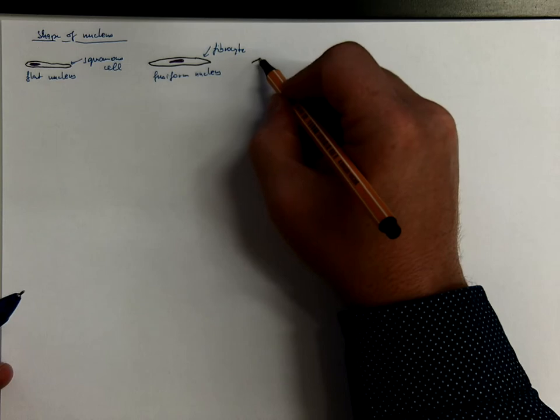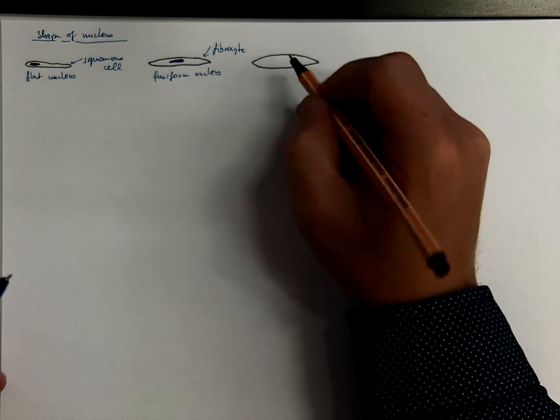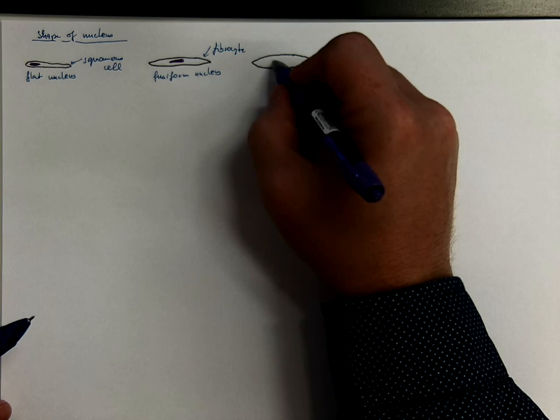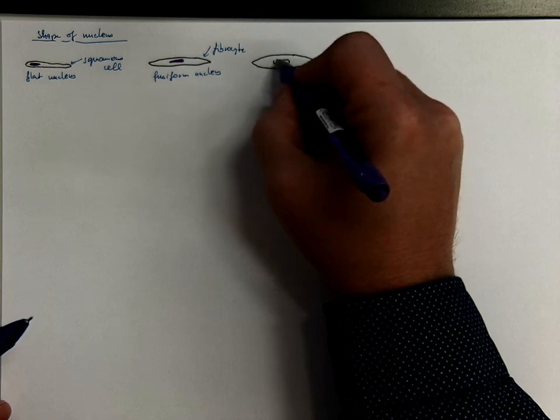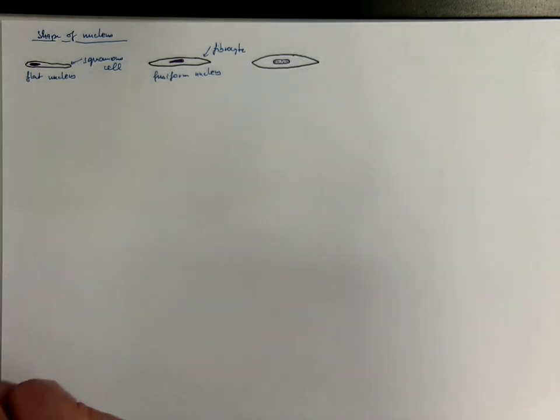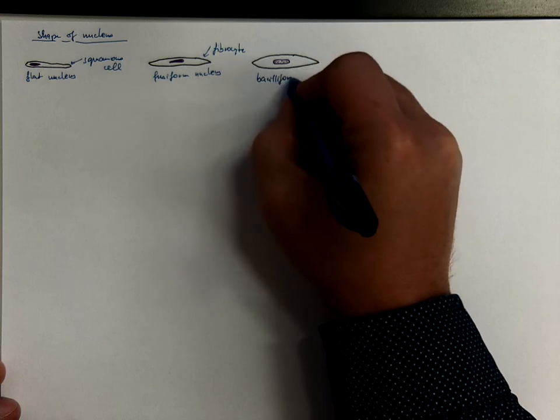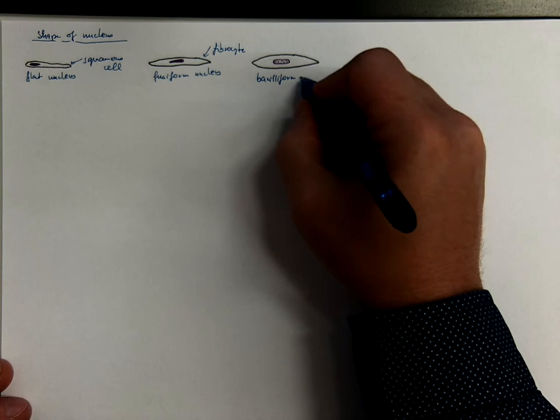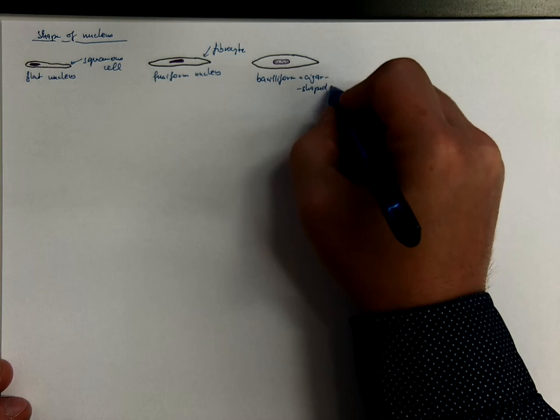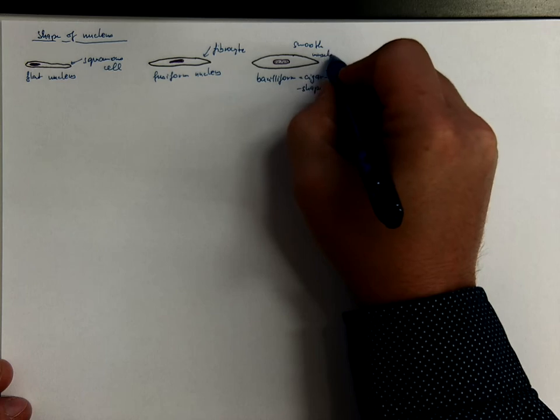Similarly, in smooth muscle cells, for example, they are cigar-shaped or bacilliform nuclei with more oval or obtuse shape. Bacilliform or cigar-shaped nucleus in smooth muscle cells.